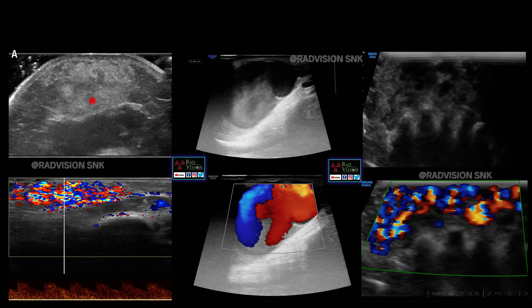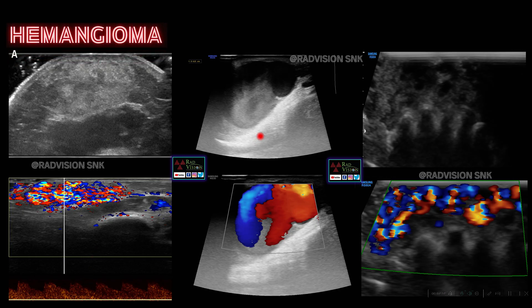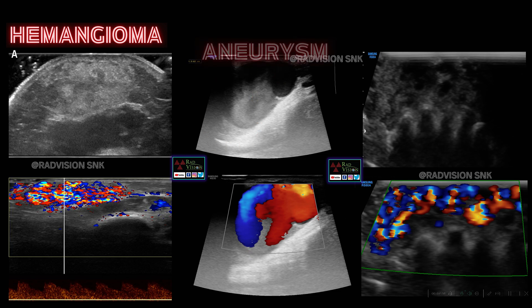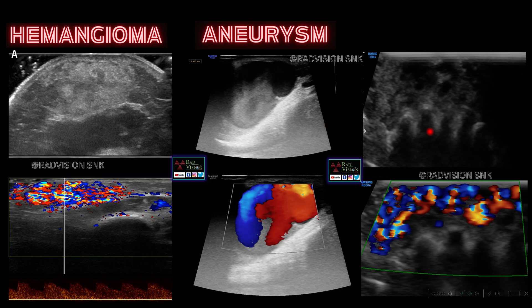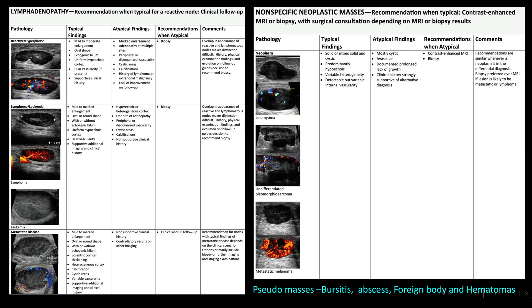Vascular masses: an echogenic mass with raised vascularity and spectral Doppler pattern was a case of hemangioma. Post-catheterization, an outpouching structure with echoes showing a yin-yang pattern was a case of aneurysm. A soft tissue mass with a 'bag of worms' appearance showing raised vascularity with both arterial and venous flow is an AV malformation. These are the common vascular soft tissue masses.